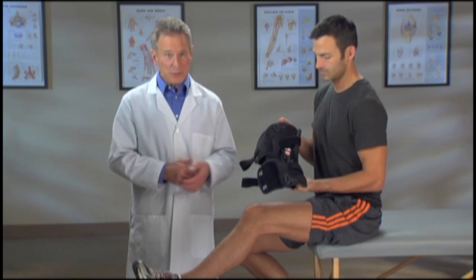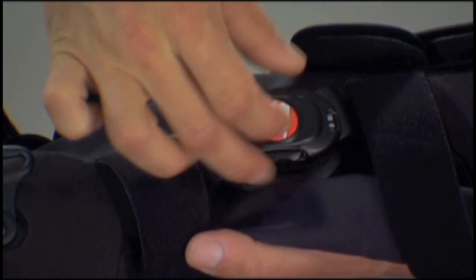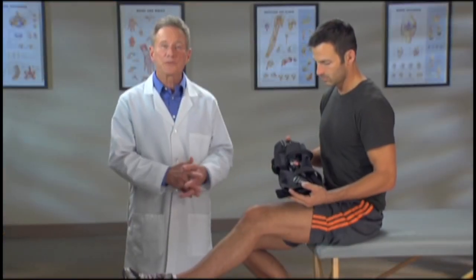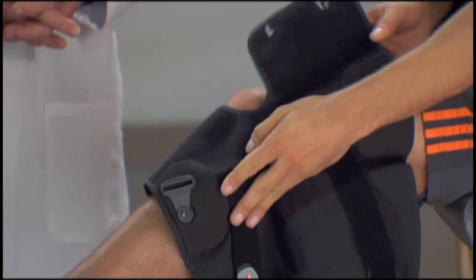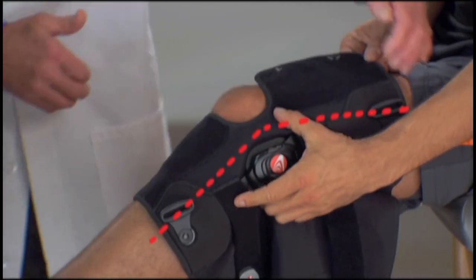The Freestyle OA is easy to put on, but before you start, first set the hinge setting to zero. Then you want to sit with your knee bent at a 30 degree angle in a gas pedal position. With the brace fully open, place it on your leg. The brace should align with the outside of the leg, like this.